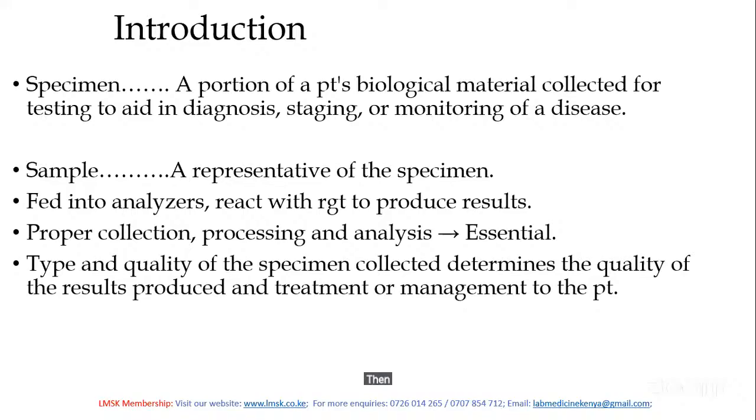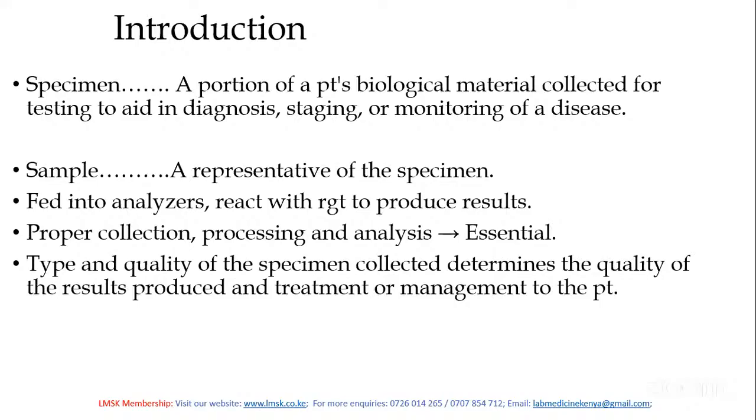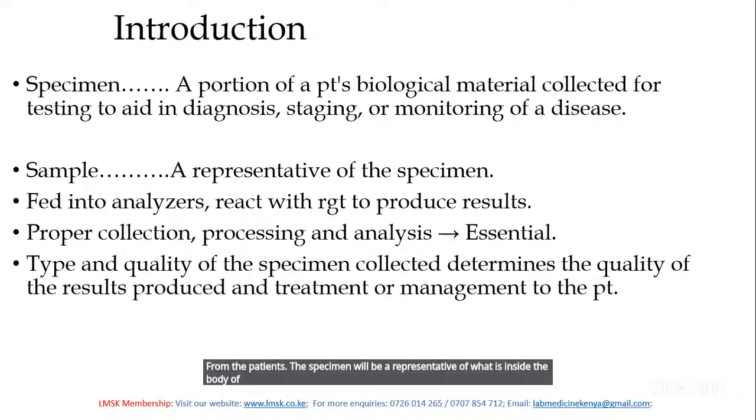Then there is also a sample. Are they the same? What we just defined is specimen. Now, what is a sample? A sample is a representative of the specimen. After getting your specimen from the patient, the specimen will be a representative of what is inside the body of the patient.